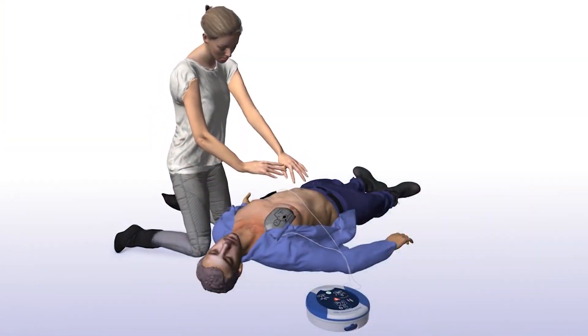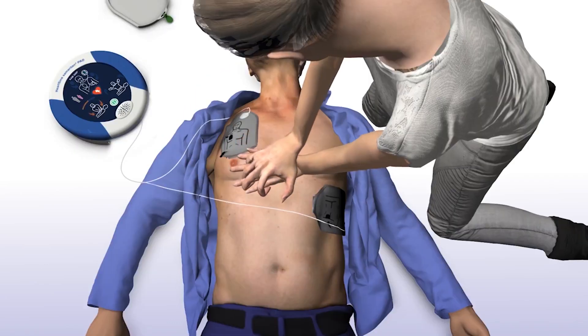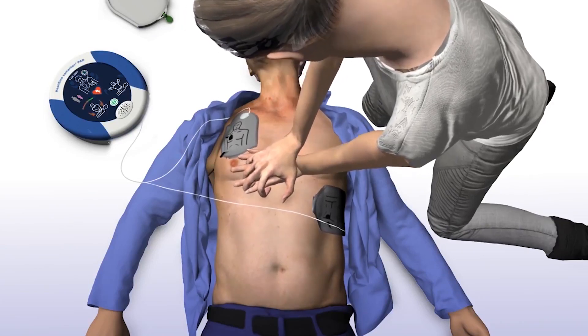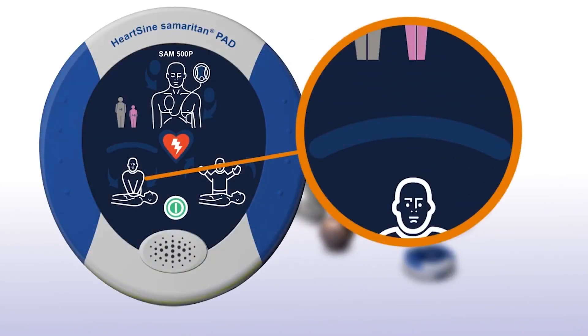Begin CPR — it is safe to touch the patient. The SAM 500P will tell you how and where to place your hands, as well as provide real-time audio-visual feedback on the rate and force of your chest compressions. Place overlapping hands in the middle of the chest and press directly down in time with the metronome. The SAM 500P also gives feedback on the force and rate of chest compressions by measuring changes in chest impedance. CPR Advisor measures the change in impedance and uses this to determine the appropriate feedback to the rescuer, advising them to adjust accordingly.